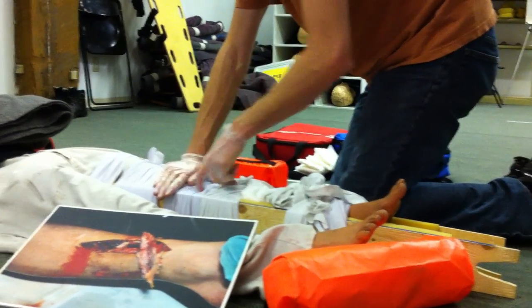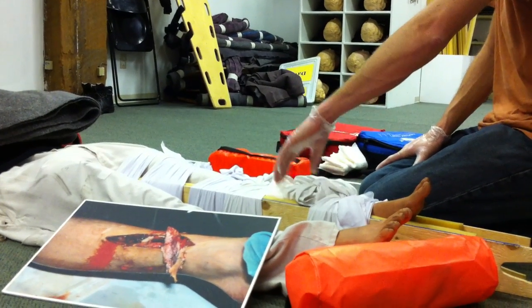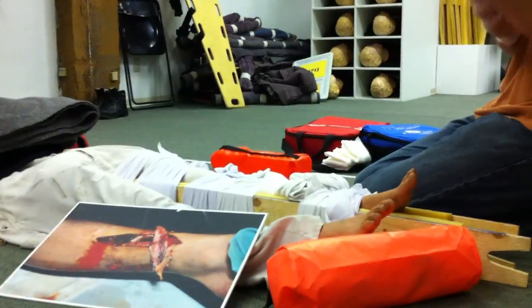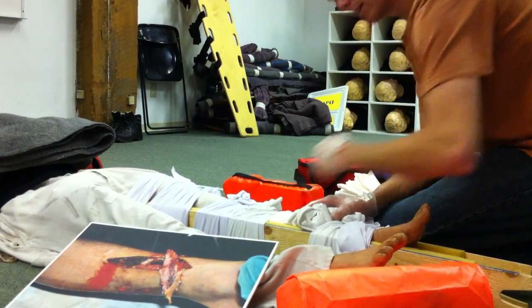Like here, I hit 2 triangulars, 2 triangulars, 2 triangulars. Down here, totally 2 triangulars. But in here, it's a little bit big. And that's a problem with your injury because you don't want to cover over your knots or the injury, so you've got access to it. My triangular is really right here. This is where the injury is. I could totally get another one slid into there.